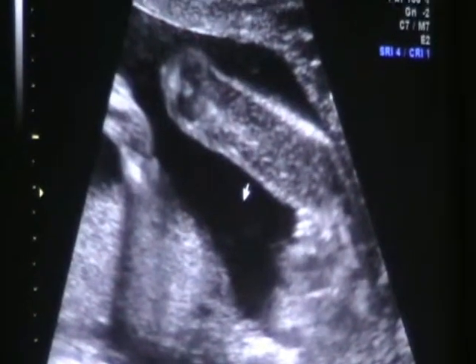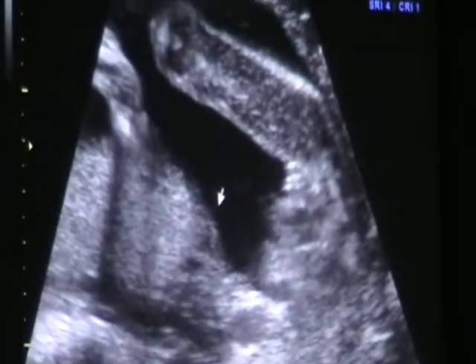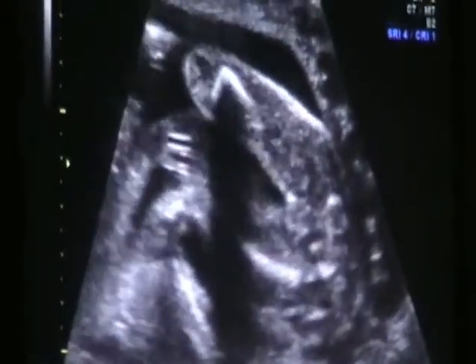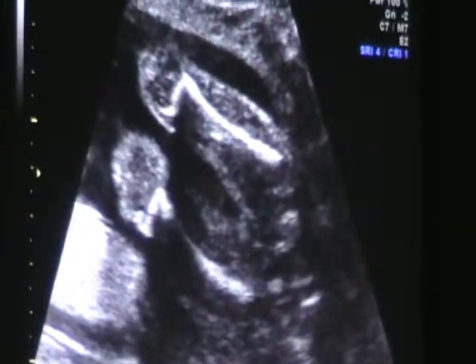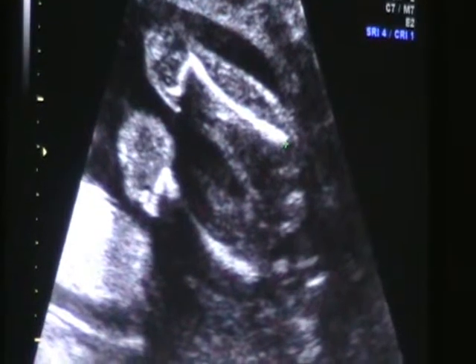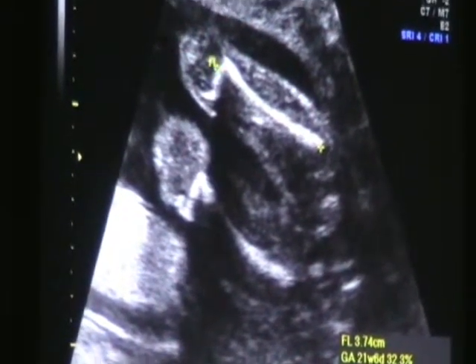She just wiggled. The girl — three little lines, that's what we've learned. That's right. There's both thighs there. Yeah, she's showing us her womb. Just like her daddy. You can clearly see the bones — they stand out really well.